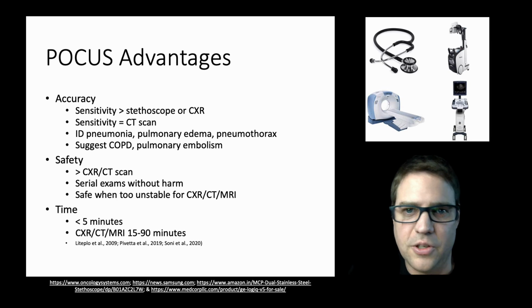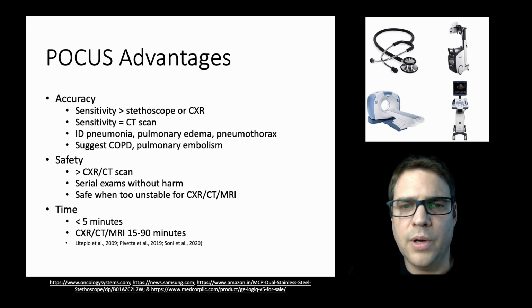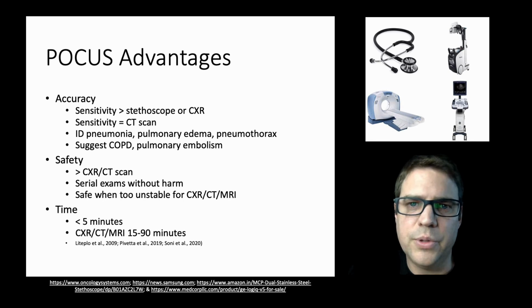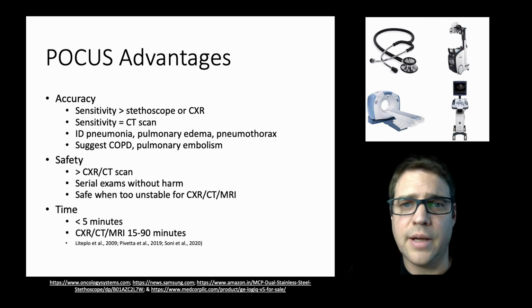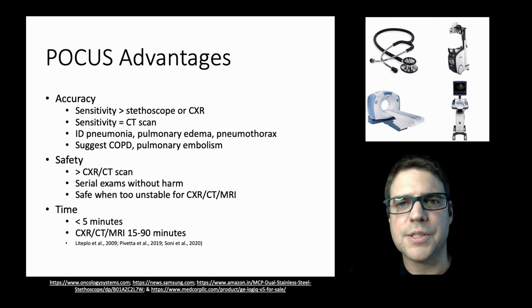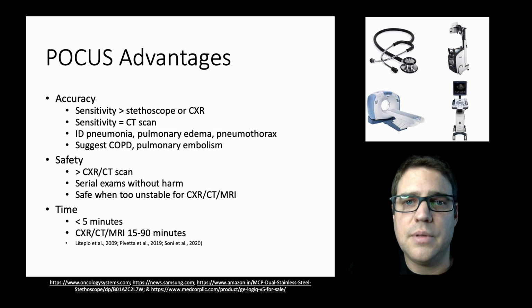Point-of-care ultrasound technology is pretty cool, but why should the APP care to learn it? Well, for one, it's kind of like the stethoscope of the future. And for another reason, it's an effective tool for the assessment and diagnosis of multiple pathologies, including those that affect the heart, the abdomen, the eyes, the joints, the bones, and especially so, the lungs. In fact, POCUS has several advantages when compared to other diagnostic modalities of the lungs.